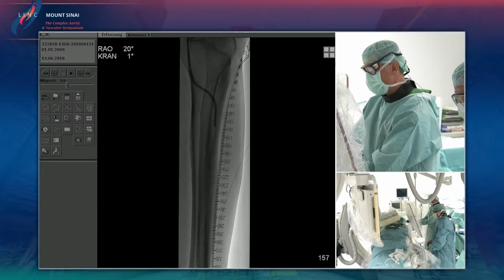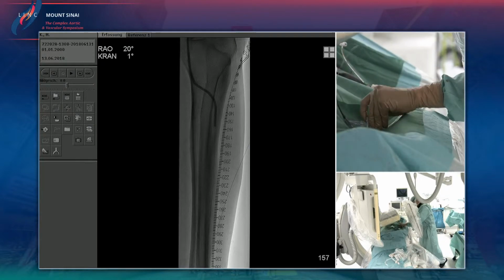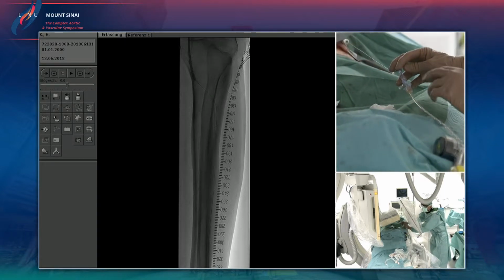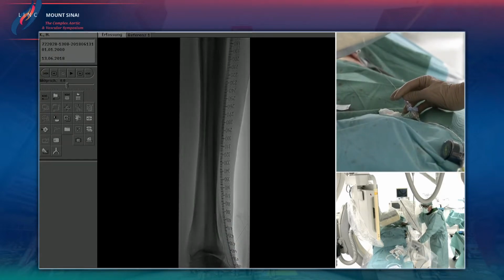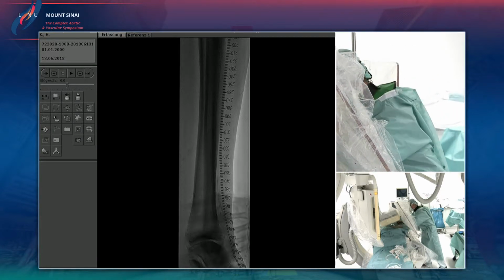Okay. Fine. So maybe Sven, you can bring already the device to show. I will give some nitro and then introduce the Bullfrog.